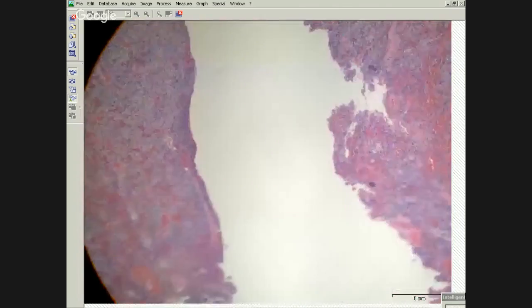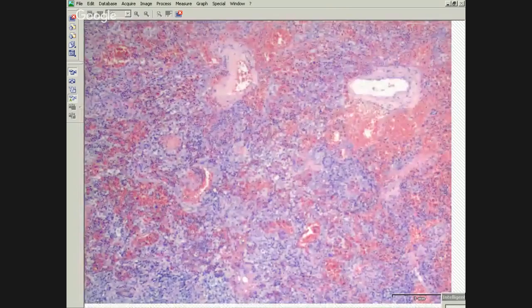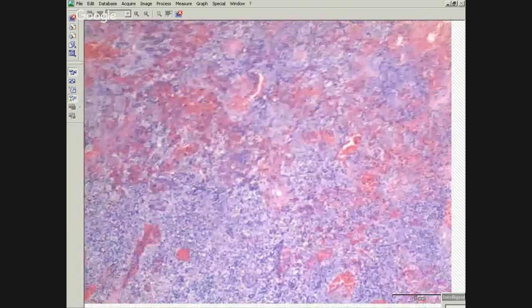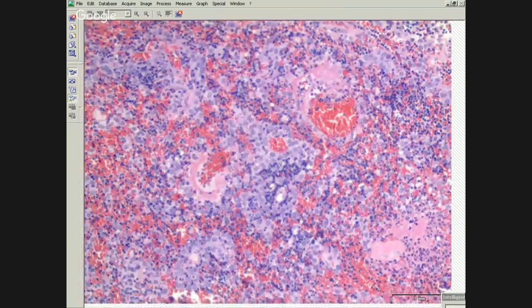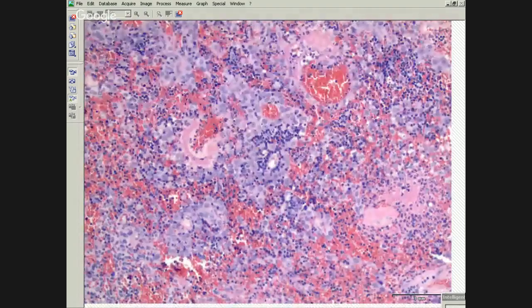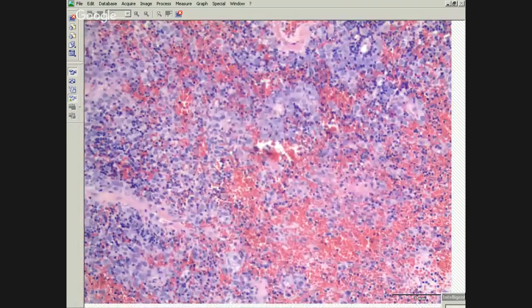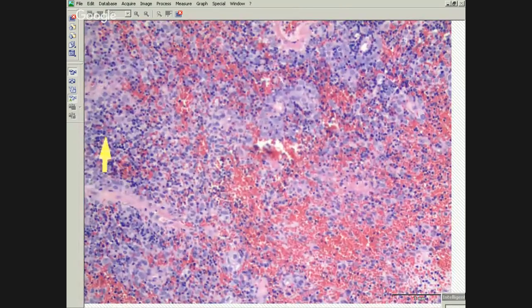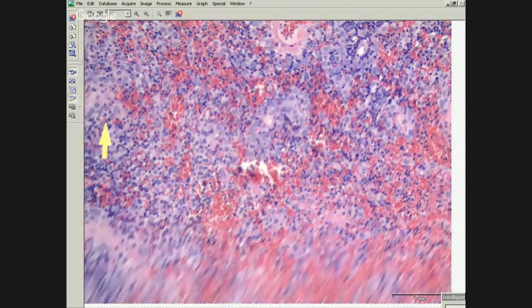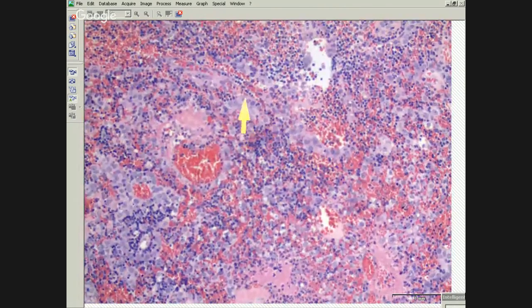Single, multiple. Multiple. Oh, this is Rosai-Dorfman, looks like. I'm not sure I could diagnose that myself. No, we'll pretend. Okay, no, it's not Rosai-Dorfman. So you've got lymphoid cells, and a lot of happy-looking histiocytes, lymphoid cells, and then you've got these guys here.